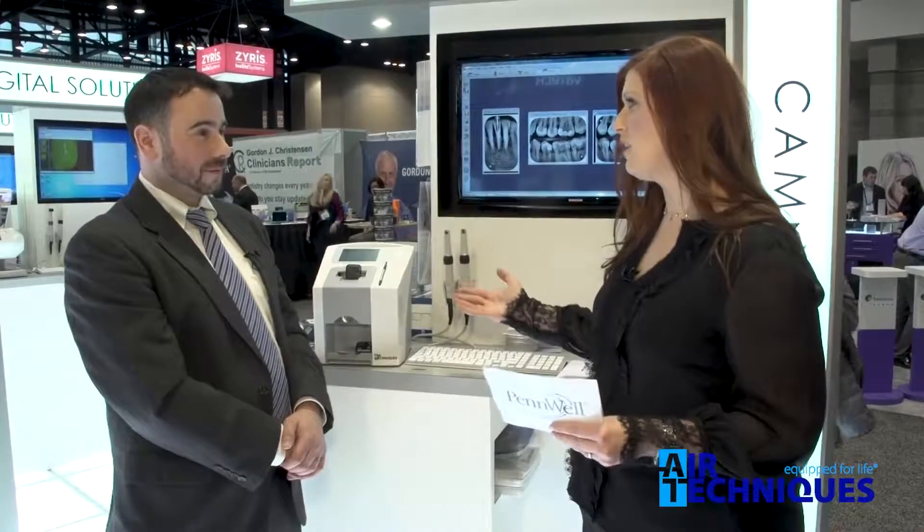Jonathan, tell me how the ScanX Swift differs from the previous ScanX models. So this is the sixth model in our ScanX portfolio, and really how it separates itself: it's a small footprint, easy to use with an intuitive touchscreen, as well as being Ethernet and Wi-Fi connected. The other models are larger and have a larger throughput — you can do up to four plates at a time, versus this being a single plate at a time.